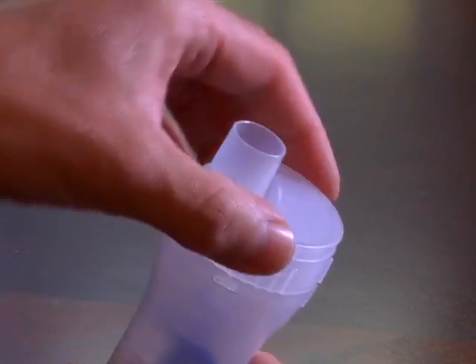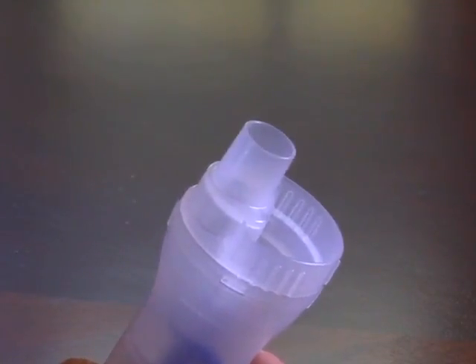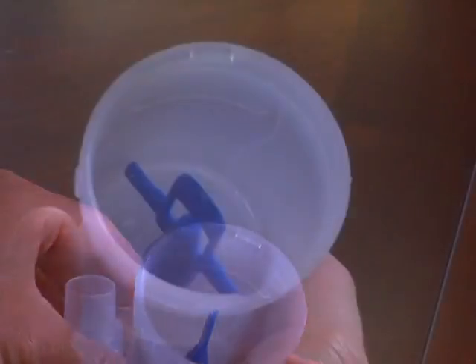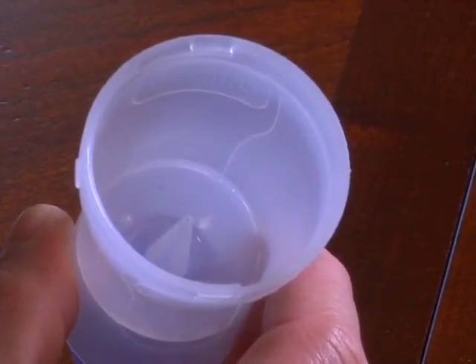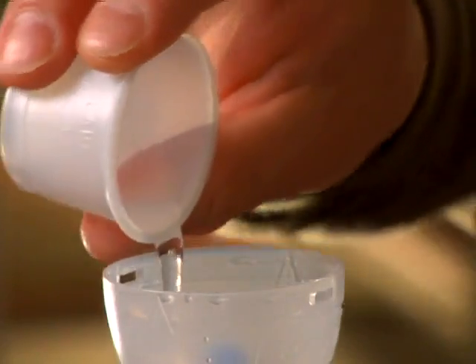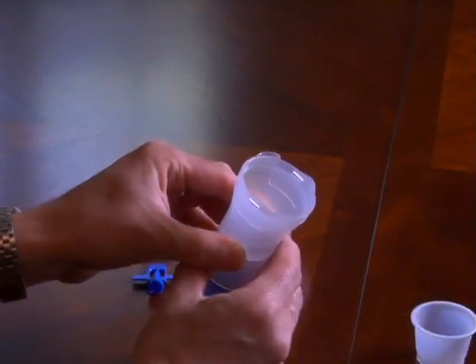Take the medicine cup and rotate the inhalation top counterclockwise, then lift it from the medication cup. Remove the baffle. Then, following your doctor's instructions, add the correct amount of prescribed medication to the medication cup. Next, put it all back together.